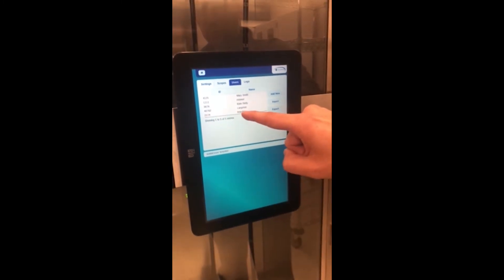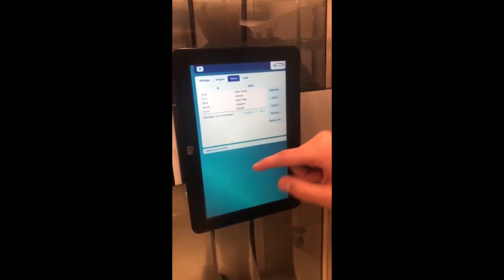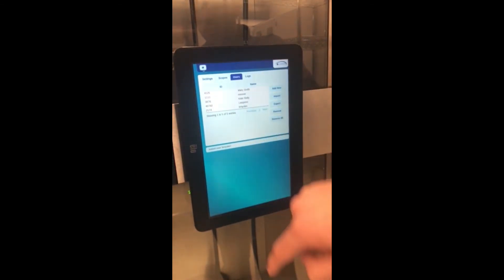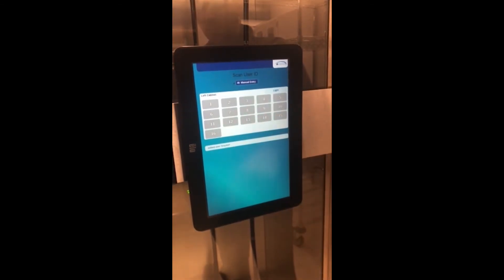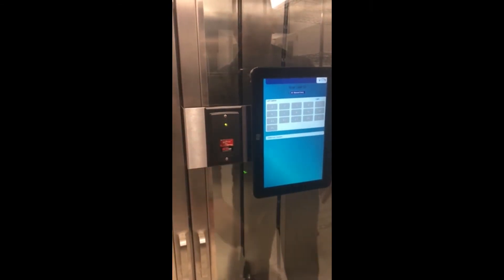Hit Enter — it then saves my name with my ID number right here. By selecting the Home button at the top, it takes me back to the home screen. Now I can scan, it unlocks the cabinet, and away you go.